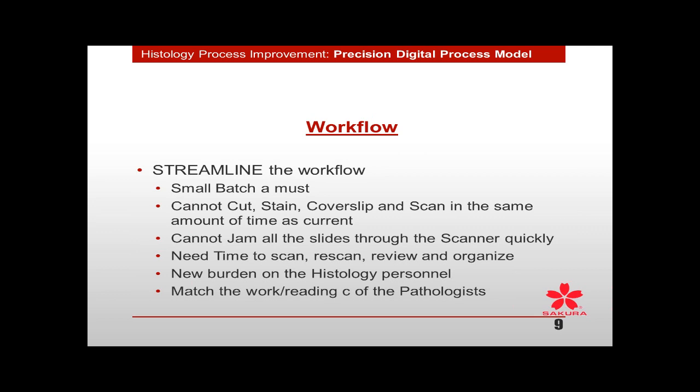But when you first start out, this is going to be a tremendous burden on the time constraints and the manpower in your laboratory. It is a completely new burden on the histology personnel. Think of it: in your department, you're very fortunate if you have everyone reviewing special stains, IHC, maybe H&Es, and involved in reviewing all of that before it goes out to the pathologist.